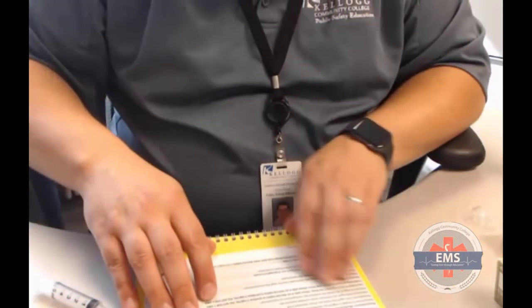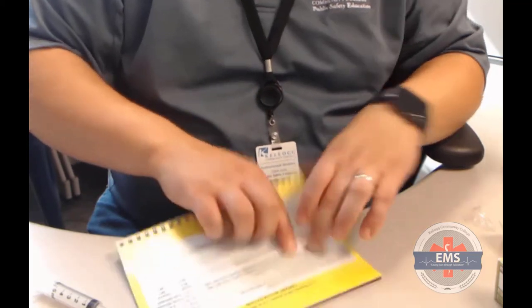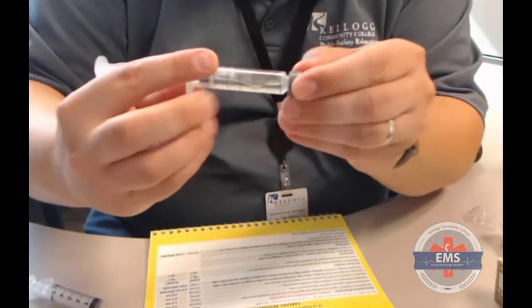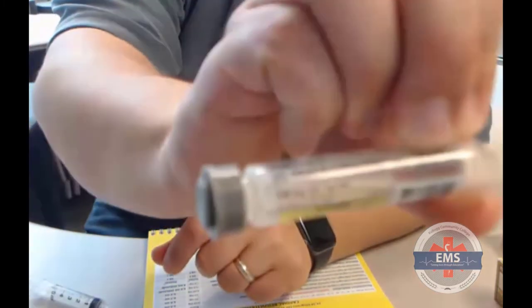So if I take a look at this, and I'm going to go ahead and give lidocaine, it's 100 milligrams in 5 mLs. That's the first thing that I'm going to reference on my card, to make sure that I actually have the proper component. In this case, I do. I look at my syringe here. Again, I can see that I've got 100 milligrams in 5 milliliters, and that this works out to 20 milligrams per mL, pardon me.